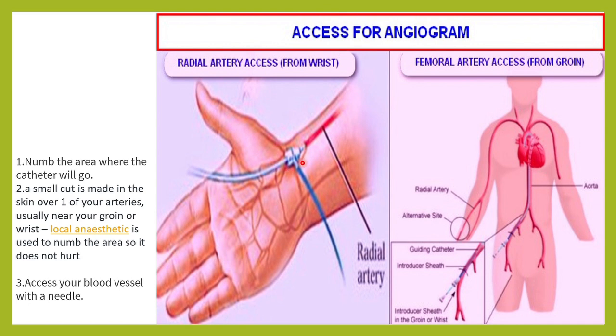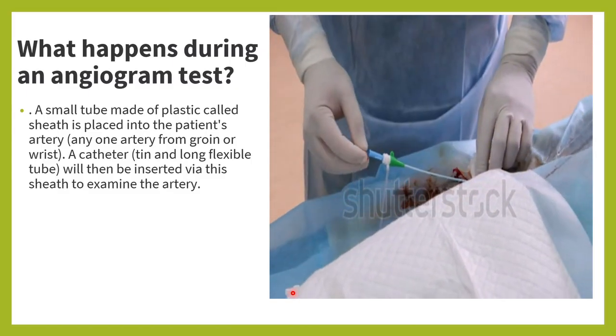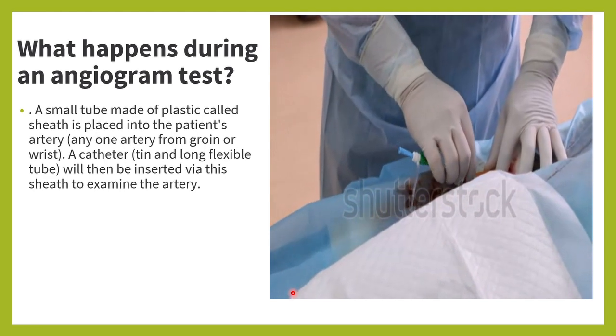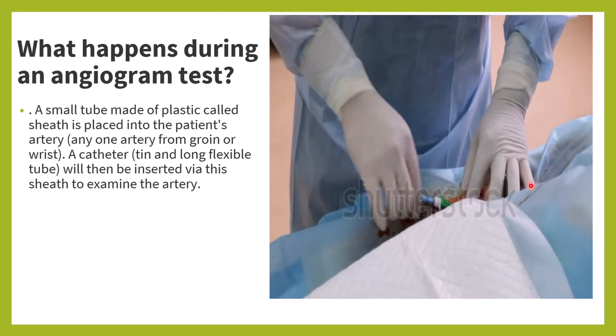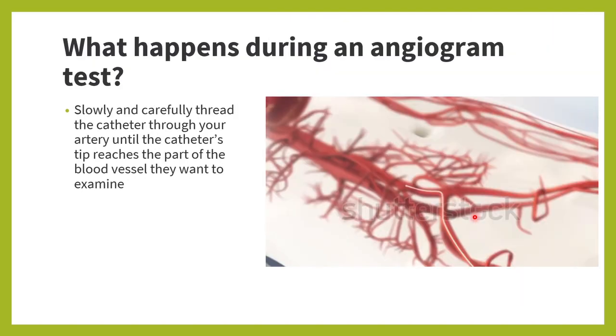A small cut is made in the skin over one of your arteries, usually near your groin or wrist, and local anesthesia is given so that we numb the area and it doesn't hurt, and they will access your blood vessel with a needle. They place this small plastic tube called a sheath, and here you can see how they have guided this catheter into the groin blood vessel. This is how the catheter is moved through the blood vessel.